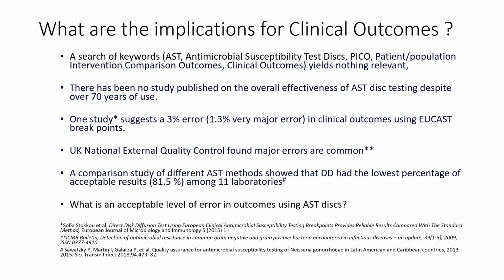So there are suggestions here that discs are not a particularly good way of predicting clinical outcomes, and so there are some concerns around this.